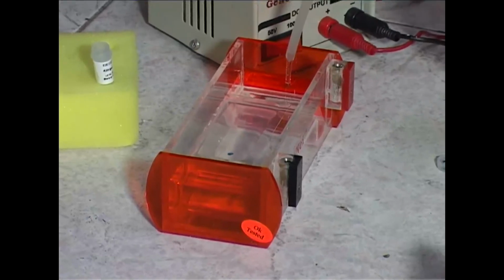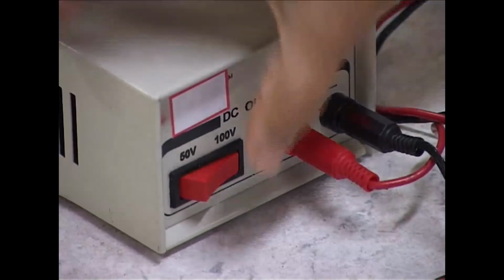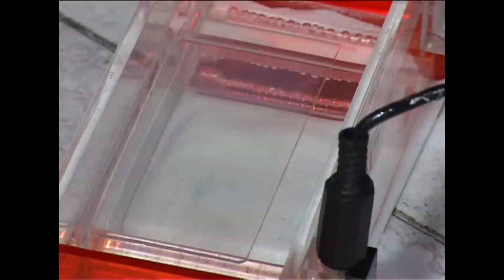So the well where we will load the antigen should be on the cathode side. Normally, 10 microliters of antigen can be loaded in a well. PBS buffer, phosphate buffer saline, is used for electrophoresis. We have to set the voltage around 50 to 100 volts, and the electrophoresis will continue. The sample will have an indicator dye. When the dye has traveled 3 to 4 centimeters from the well, we will stop the electrophoresis.